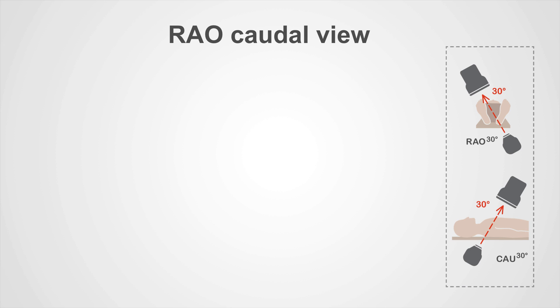Now let's take a look at the left coronary artery. This is an altogether more complicated artery with more branches. We're going to look at it in a couple of views to help you orientate yourself. We'll start off with the RAO caudal view — as you can see from the key, this is RAO 30, caudal 30.